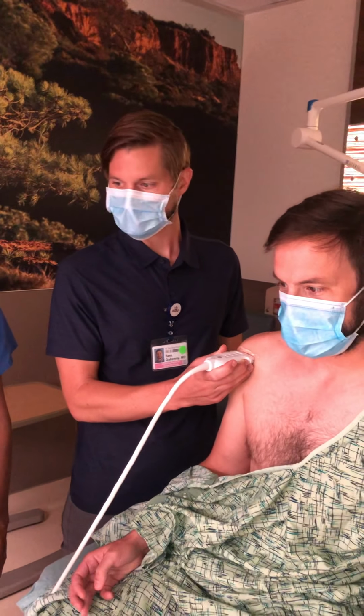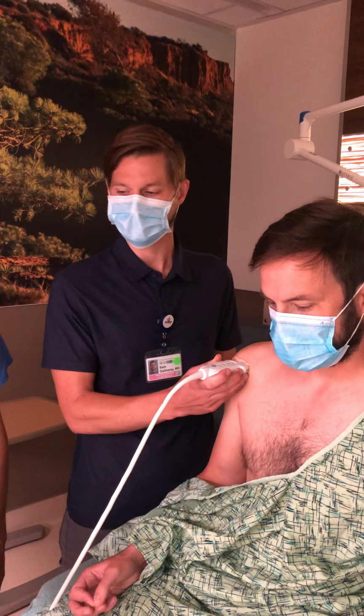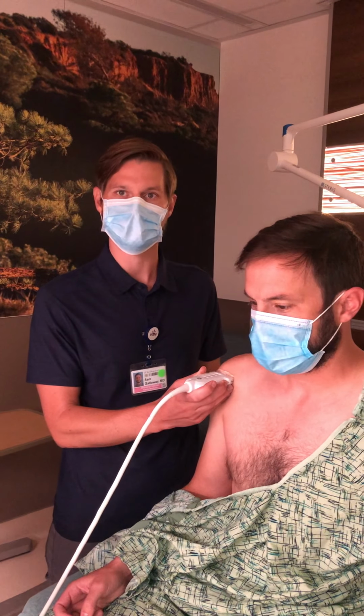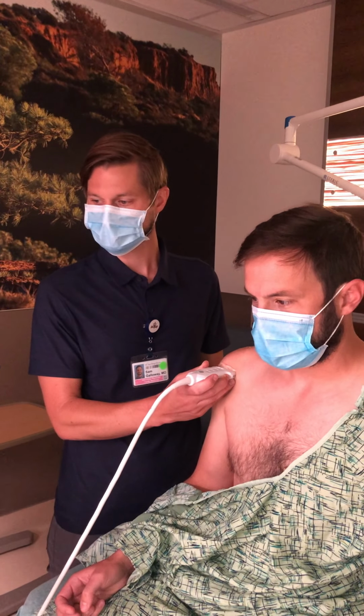So we use this in clinic for diagnostic purposes, so we take a look at the biceps tendon, the rotator cuff tendons. We can look a little bit at the bony cortex as well, mainly using it for diagnosing tears or tendinosis or bursitis, a fluid accumulation.